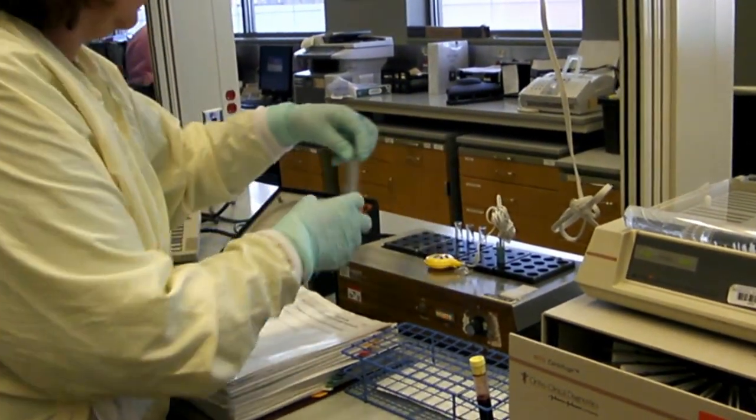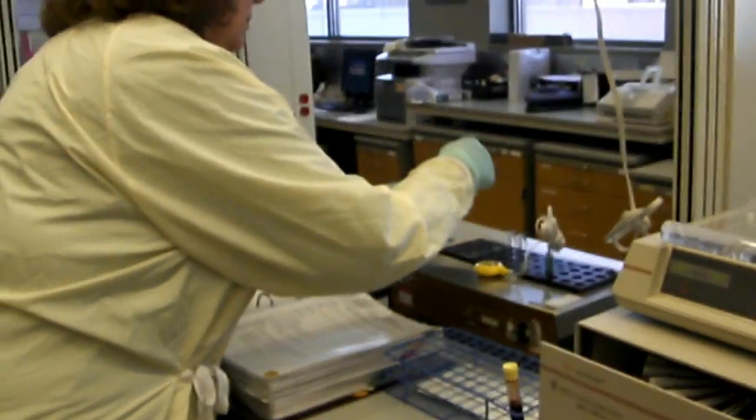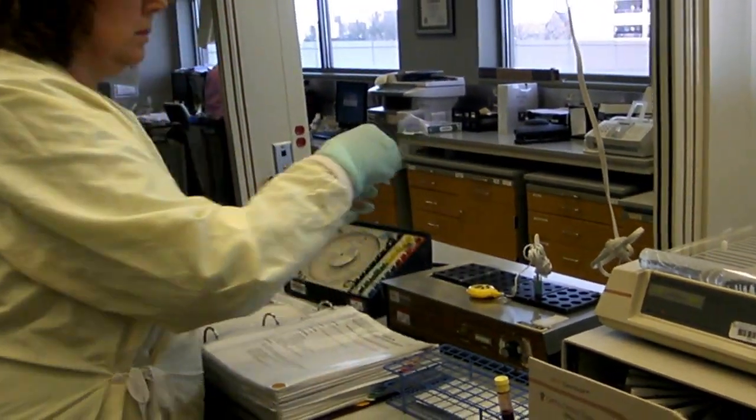After the 15 minutes at 37 degrees, the test must now be washed to remove all the patient's serum and the enhancement reagent.